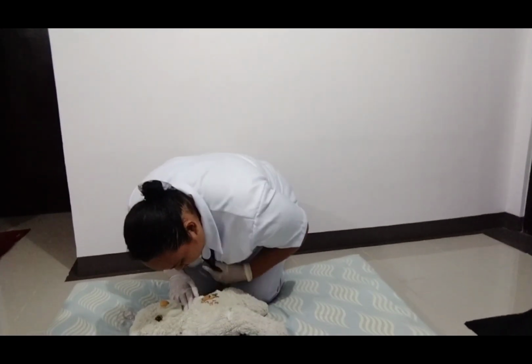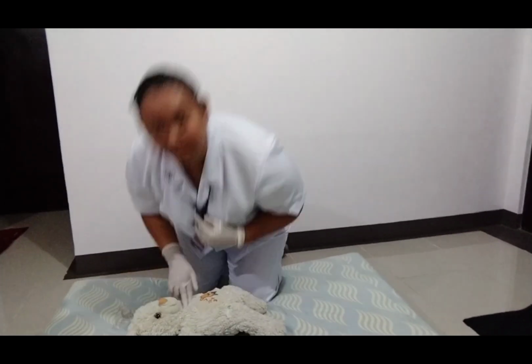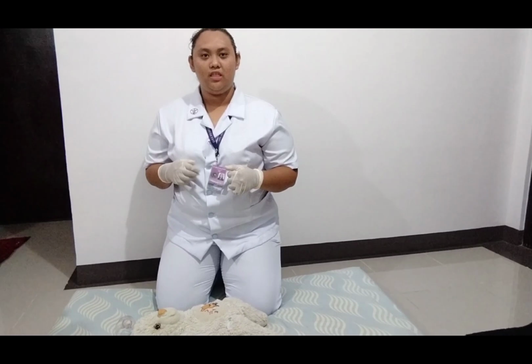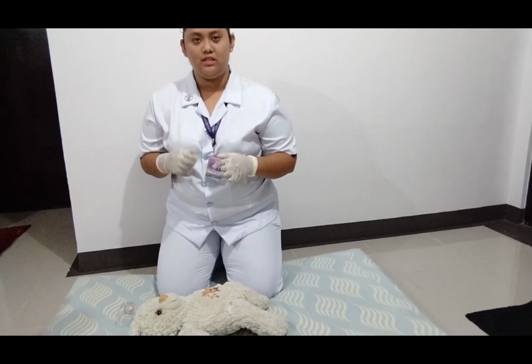1, 2, 3, 4, 5, 6, 7, 8, 9, 10. So the patient is not breathing. I'm going to give the patient 2 rescue breaths. I'm going to get the face mask, cover the patient's mouth and nose with it, and deliver the 2 rescue breaths.